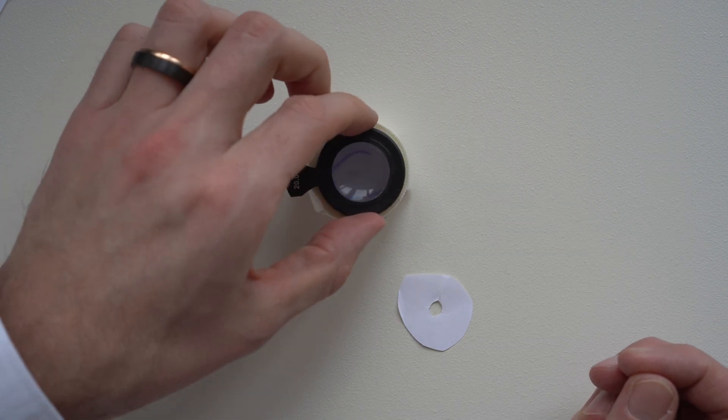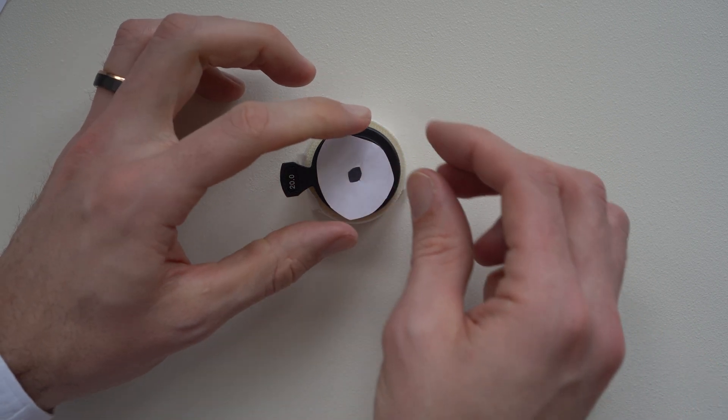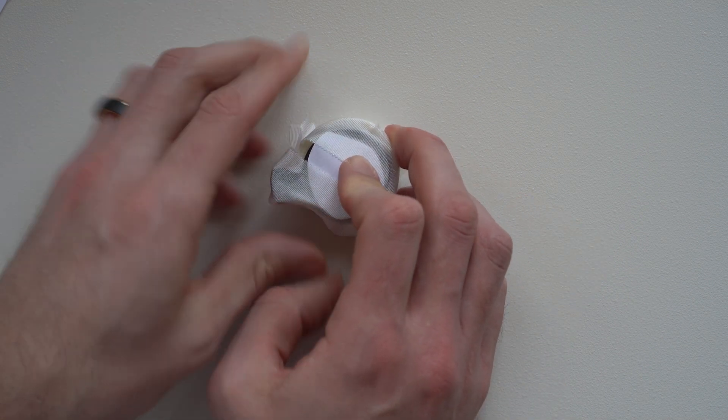Then place the 20 diopter lens onto the roll of tape, put your artificial pupil on top, and stick those two things onto your roll of tape using two out of the three strips you just set aside. That's it — you're done with your eye model.